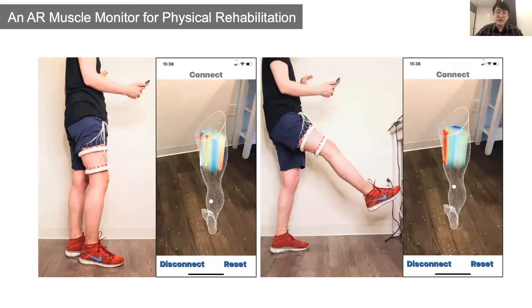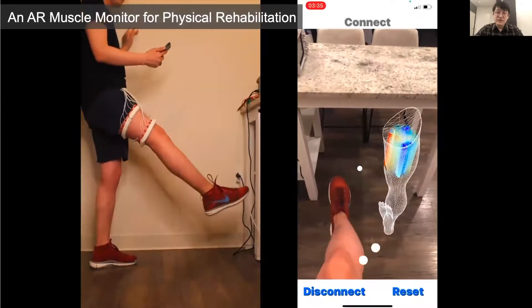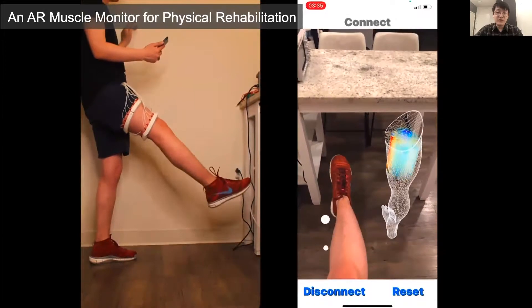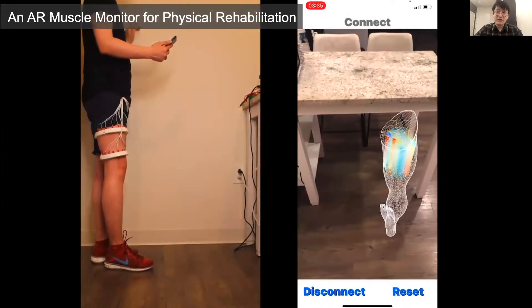Now that I've shown you each component of EIT Kit, I'll briefly demonstrate its applicability with a range of EIT devices designed via EIT Kit. First is an AR muscle monitor for physical rehabilitation. This device can sense muscle strain and tension in the thigh to monitor muscle activities. In the app view, the red part indicates muscle tension while the blue part shows muscle stretch. The device uses two electrode arrays — 16 electrodes each — to create a 3D volumetric rather than 2D sectional image of the thigh, reducing measurement error due to device shifting during movement. The visualization is displayed in AR over the 3D model to illustrate muscle activity location in real time.